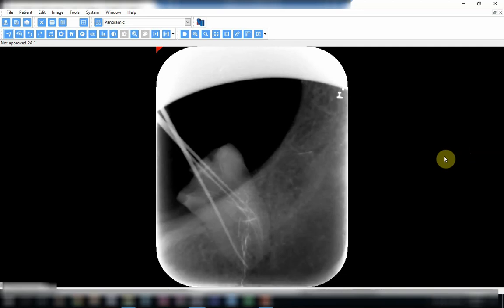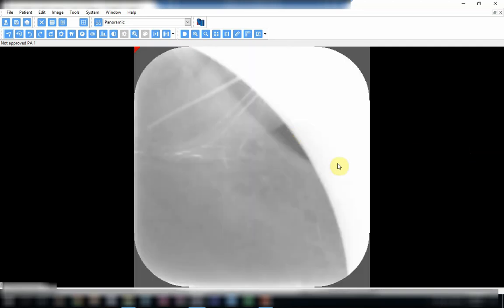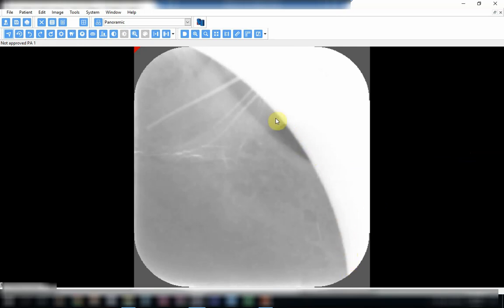See this X-ray over here. This X-ray has two problems. The first problem is that it was underexposed, meaning the exposure time is less than what is needed. The second thing is that it has a severe cone cut that has completely cut off the crown.